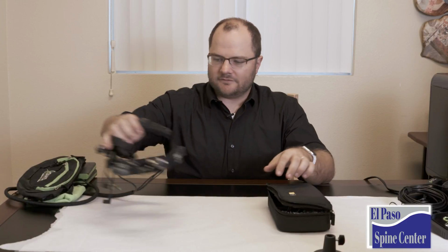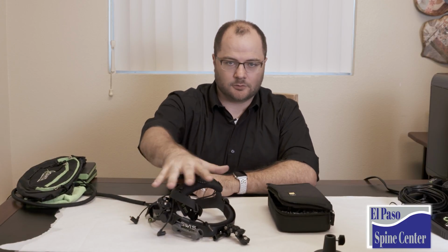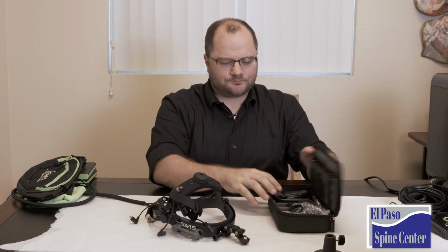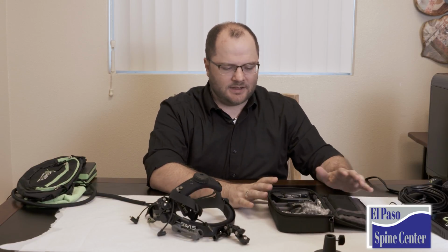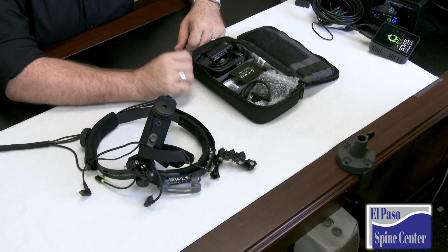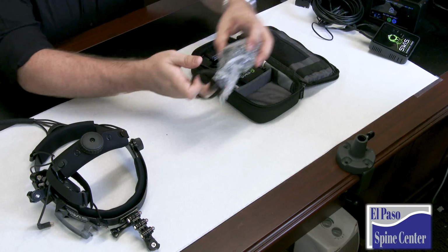Now let's take a look at our headgear and that pouch that we brought out earlier. So we have our headgear here. I'm just going to worry about the top part of the headgear for the moment because that's the part where we're going to be doing our starting work. In this pouch, I tried to set this up the way that we got it so there wasn't any confusion between what you're going to get versus what you see, but it might be a little bit different in here and there. There are several different components of the headgear that we're going to use.